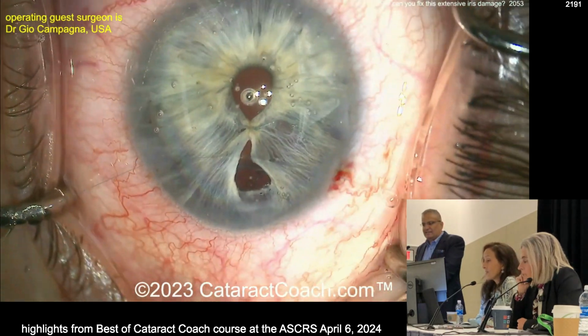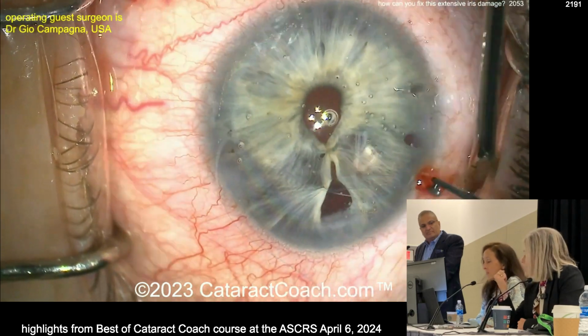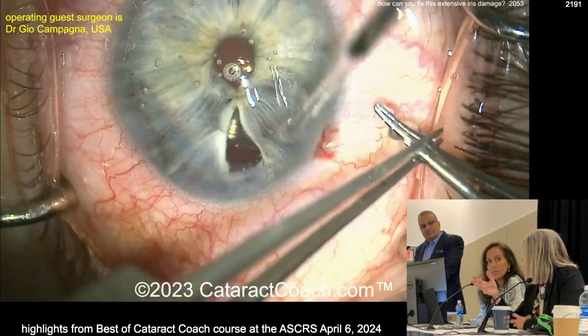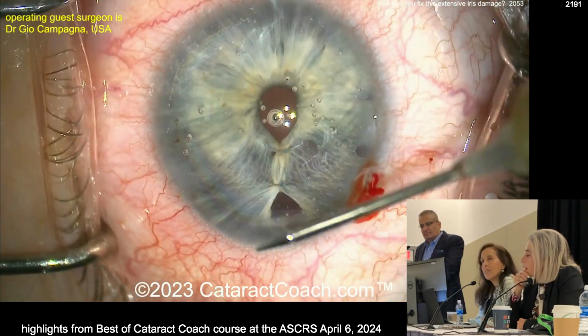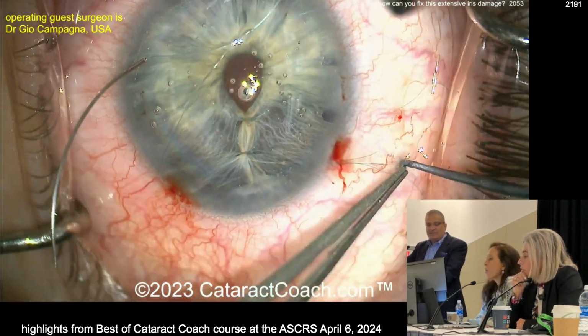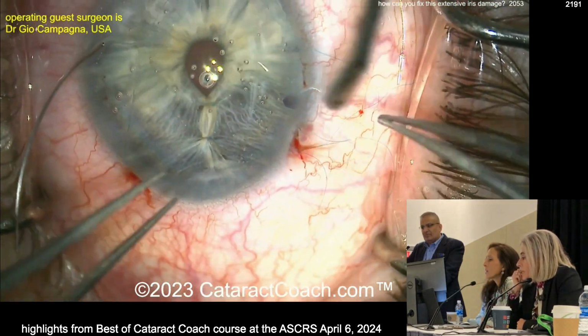The tough part here is these patients with these really light-colored irises, they are just fragile and delicate. And so for the other eye, you also want to make a longer incision, like DP said in the first cases. You don't want a shallow incision. In fact, what you might want to do is even a scleral tunnel incision or something that might go up into the cornea to make sure that the iris doesn't come out. And you can preemptively put an iris hook subincisionally to make sure the iris doesn't come out. I think a subincisional iris hook would be a great idea. They did a lovely job sewing this up with such a thin iris.